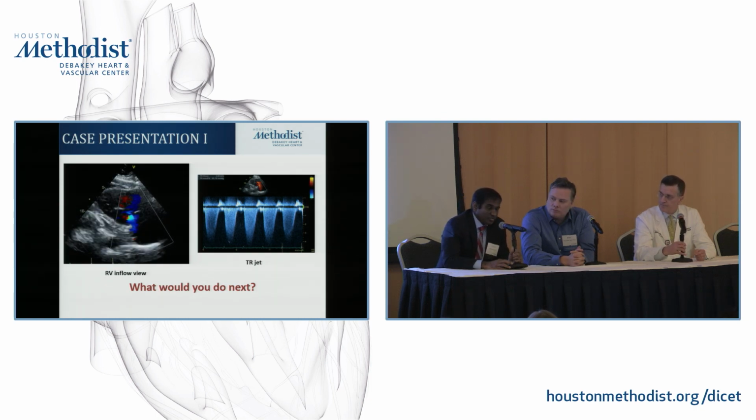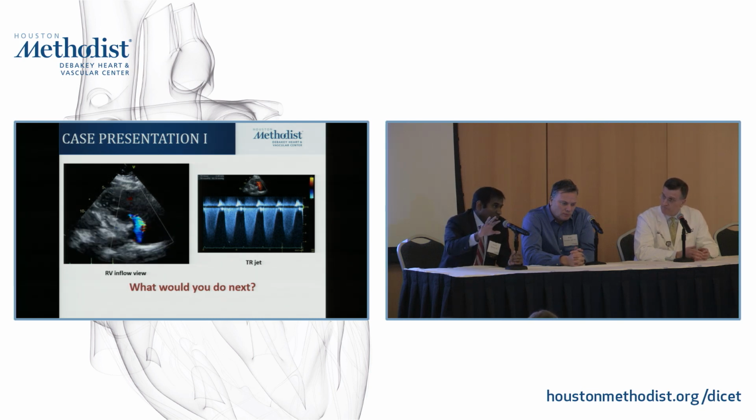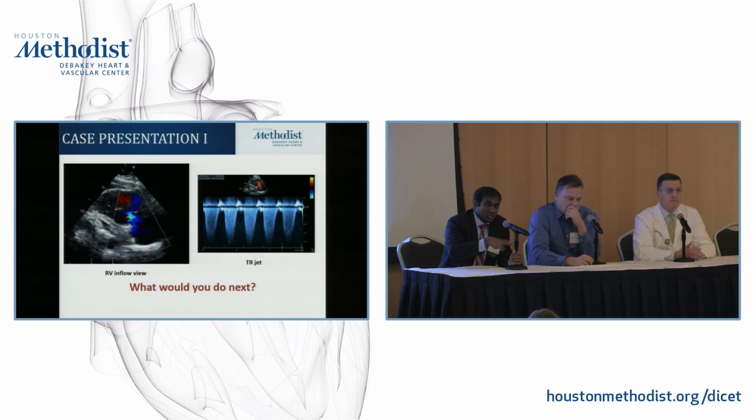Tom, I think you brought up a good question. I've got to go do some simulations in the PV loops. But if you think about it, and this is a unique situation, your LV doesn't get decompressed because of arterial afterload, because you're sucking blood from the venous circulation and pushing into the arterial. That's an important concept to recognize for anybody who uses ECMO, because what Dr. MacGillivray is talking about is that we have a false perception that the blood pressure is high, because in an ECMO, the blood is being sucked out of the venous system and pushed back into the arterial system. But that arterial flow and pressure is what an LV has to pump against. Especially if you put in an ECMO for a weak LV, that is going to be high resistance.